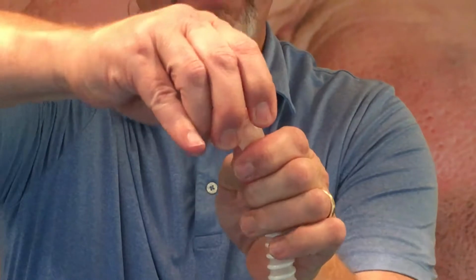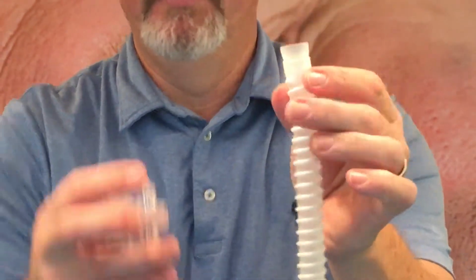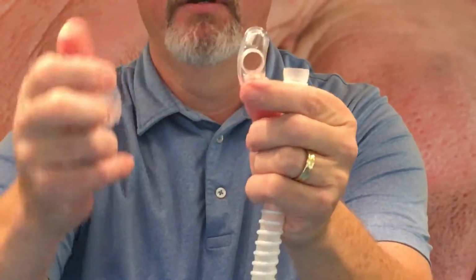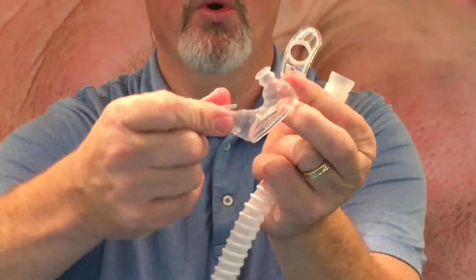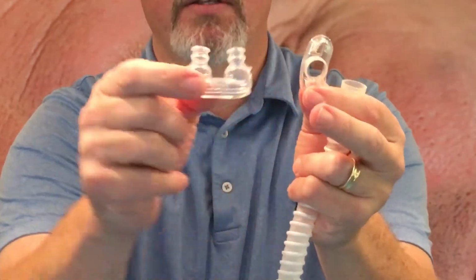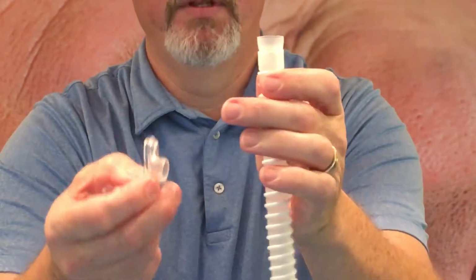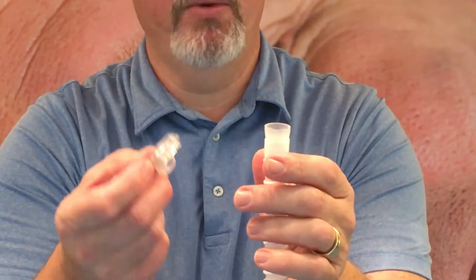I'm going to snap the vent off the vent swivel, which is already put into the tube. I'm going to remove the silicone from the vent itself. And then I'm going to take the silicone and remove the QR sockets. And now what you have are four components: two QR sockets, the silicone, the vent swivel.